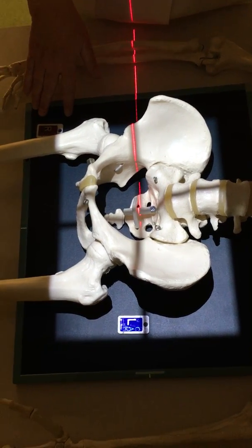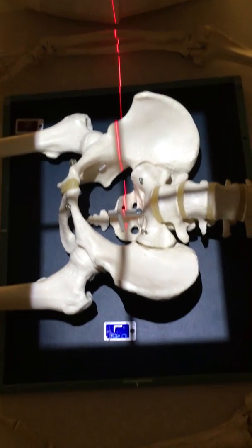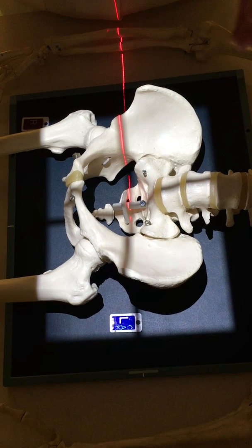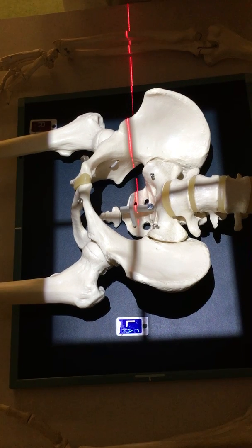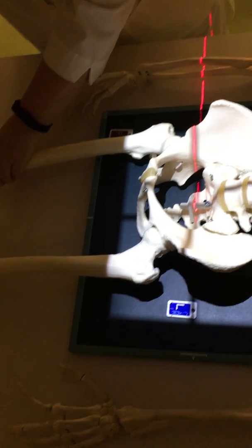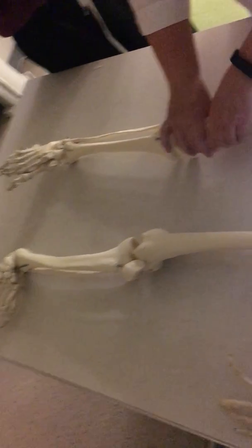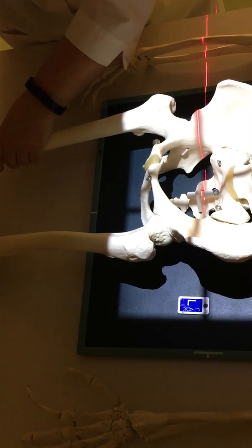Where I placed my right marker over here, it is collimated off. So you need to pay attention to where you're placing your marker so that when you do collimate, the marker will be within the collimated border. Before you take your exposure, make sure to separate the feet and rotate the ankles so that the greater trochanters are now seen in profile.